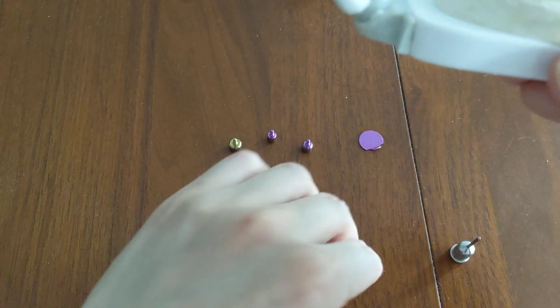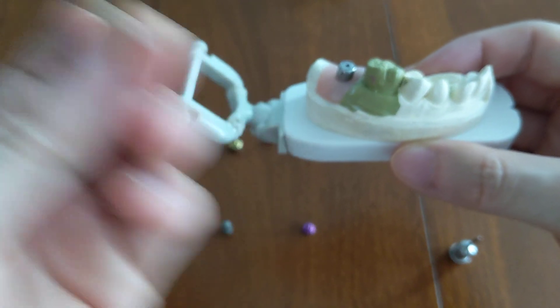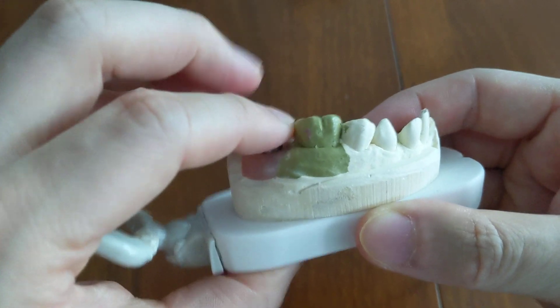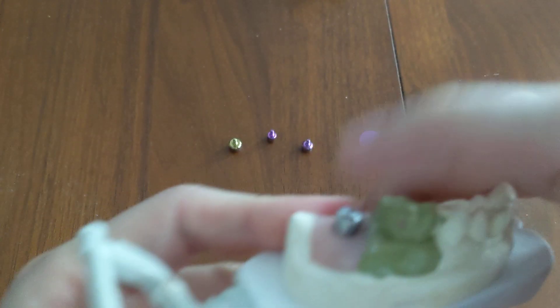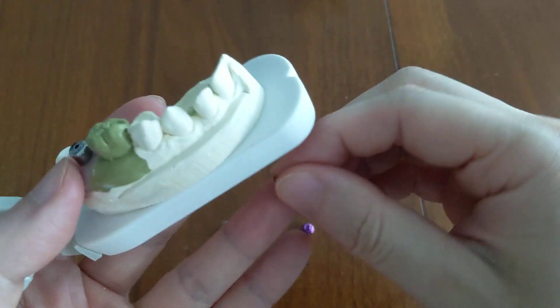With the cover screw you won't be able to feel it with your tongue — it will be as if you had nothing there. But with the healing abutment, it will feel like you have something there.